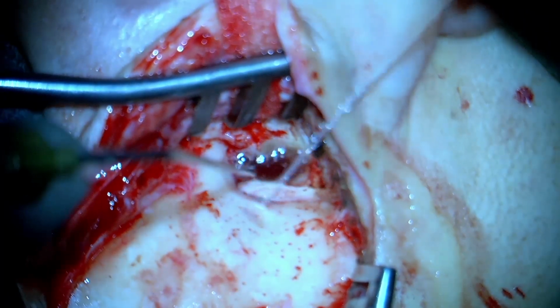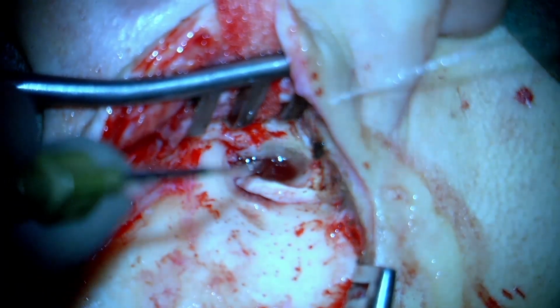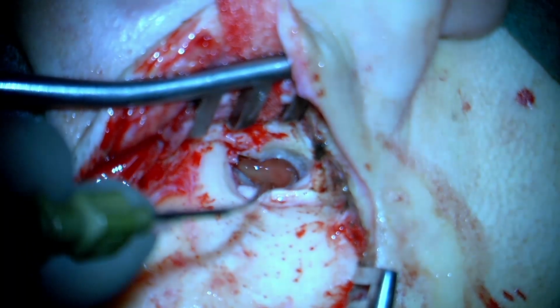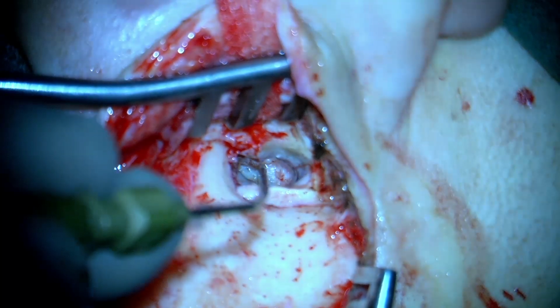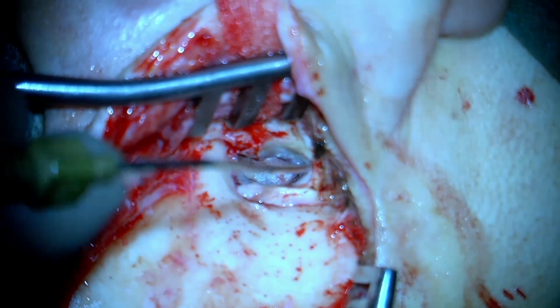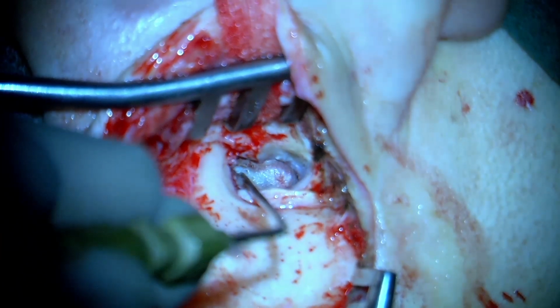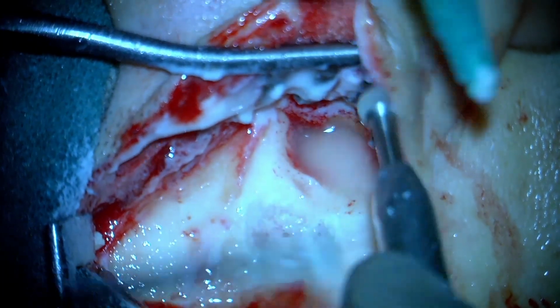Now, you have to first observe and see by this approach. Our plan is to do a cortical mastoidectomy and a sort of anterior posterior mastoidectomy. In case the cholesteatoma is not affecting the antrum and the rest of the mastoid air cell system, we would prefer to conserve the canal wall. That could be difficult given that the patient already has a large canal wall defect, which by itself sometimes happens to be an indication for a canal down mastoidectomy.